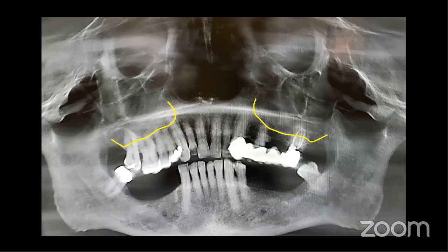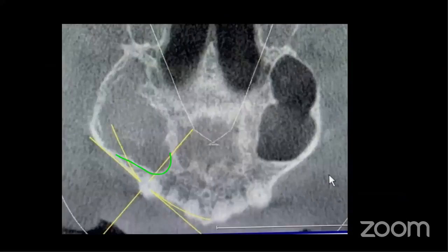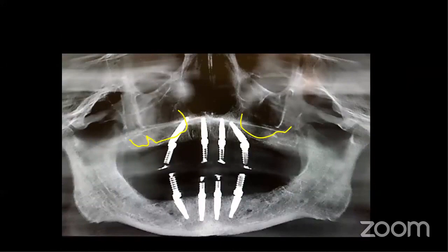And so when we see these sinuses that are very big, very pneumatized, very anterior, by the time you reduce bone, that really limits the amount of available bone you have for engagement of implants. With this case, we could see that on the right side in particular, this sinus is very anterior. It's beyond the canine, almost to the lateral. So in this case, I did a trans-sinus implant. I went through the sinus, engaged the piriform rim. And unfortunately, that implant failed.